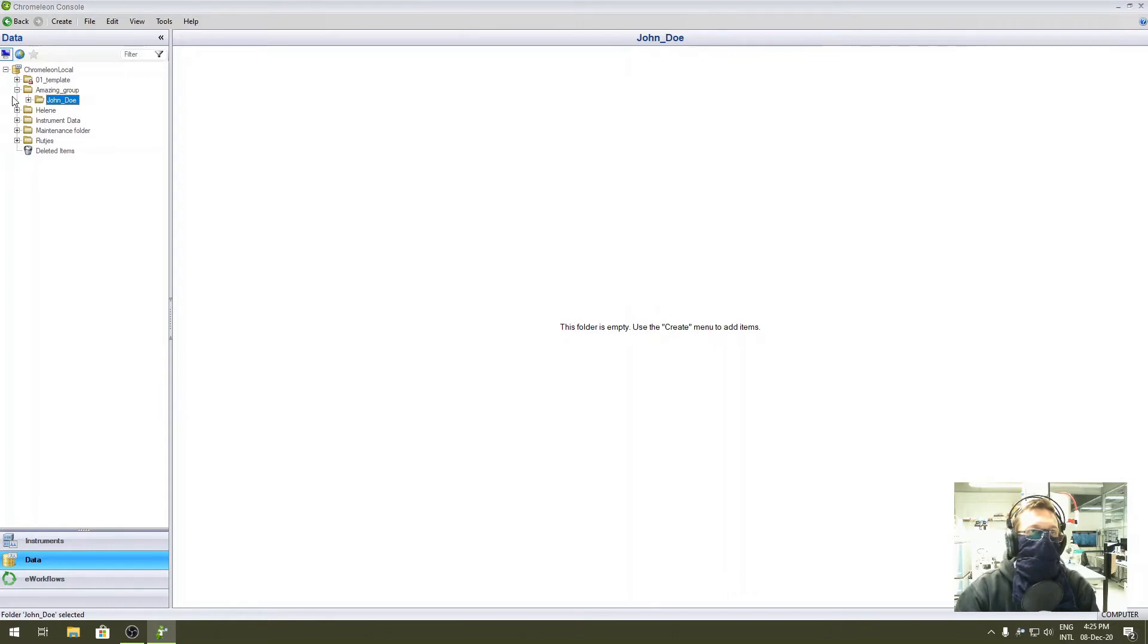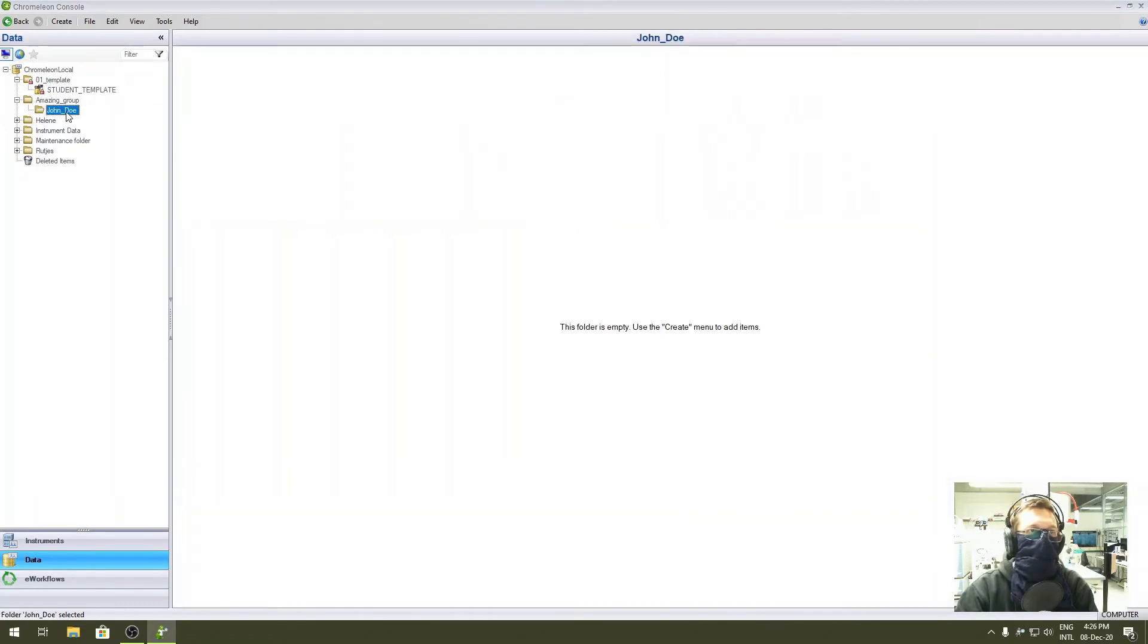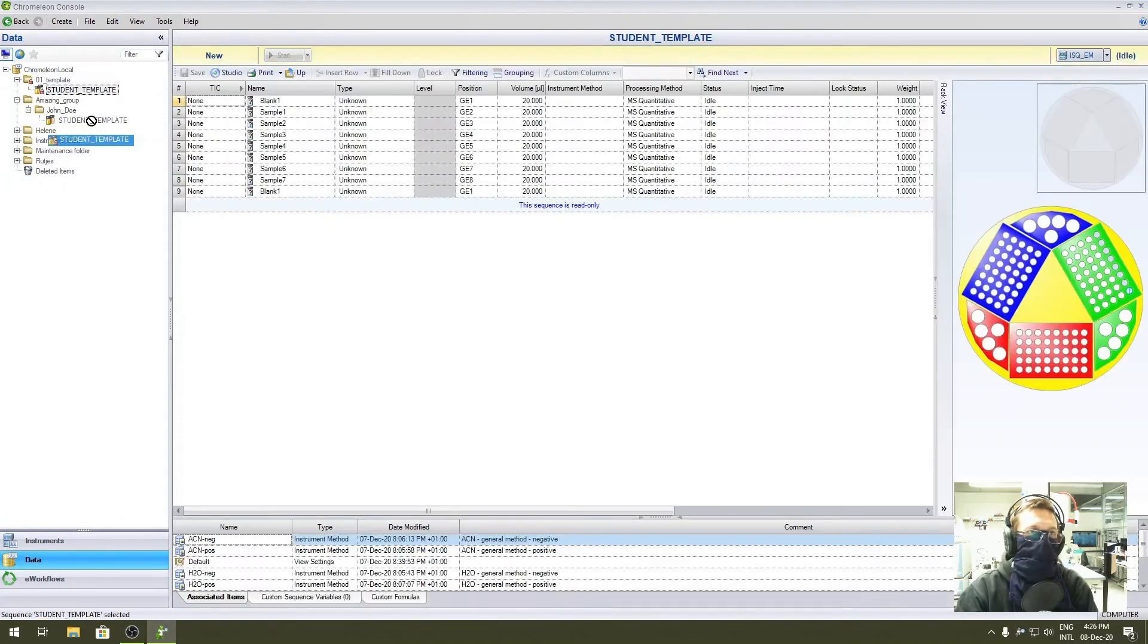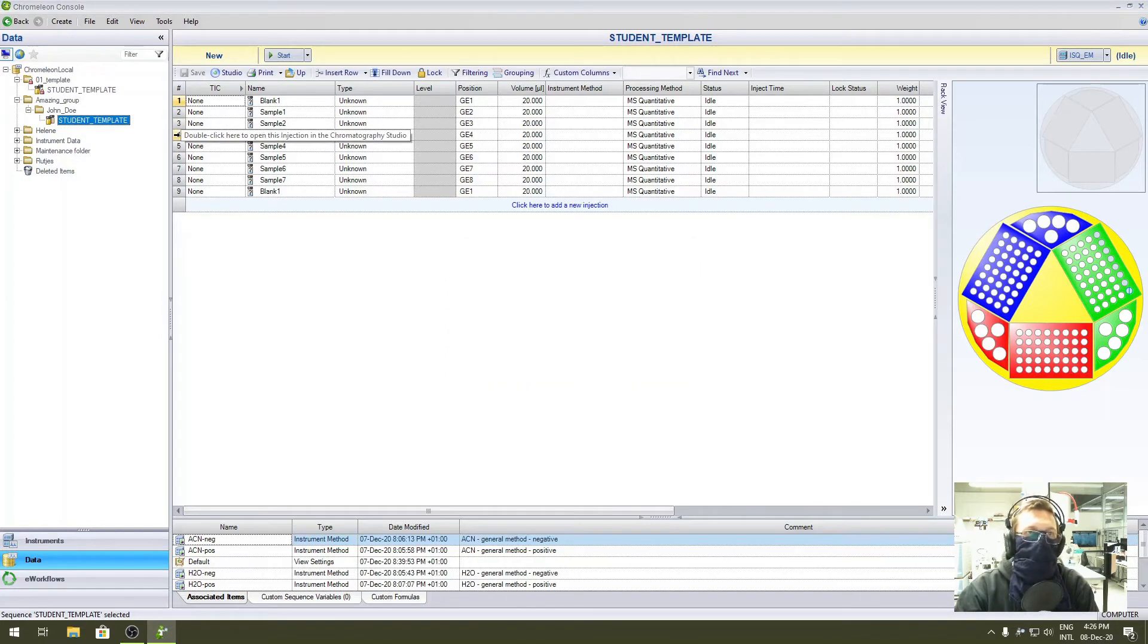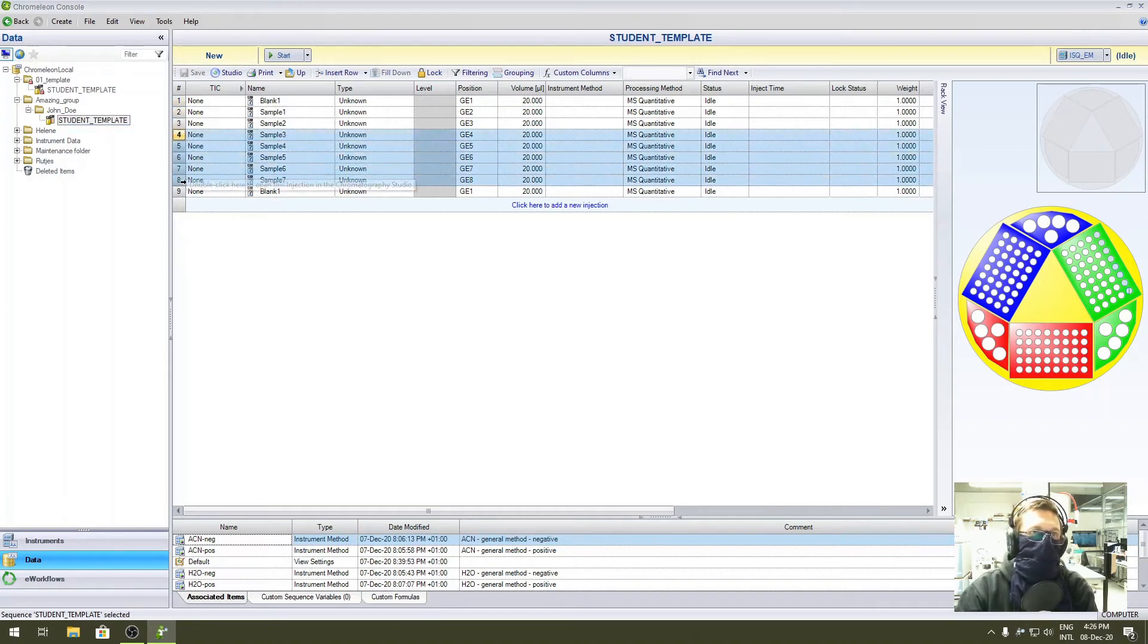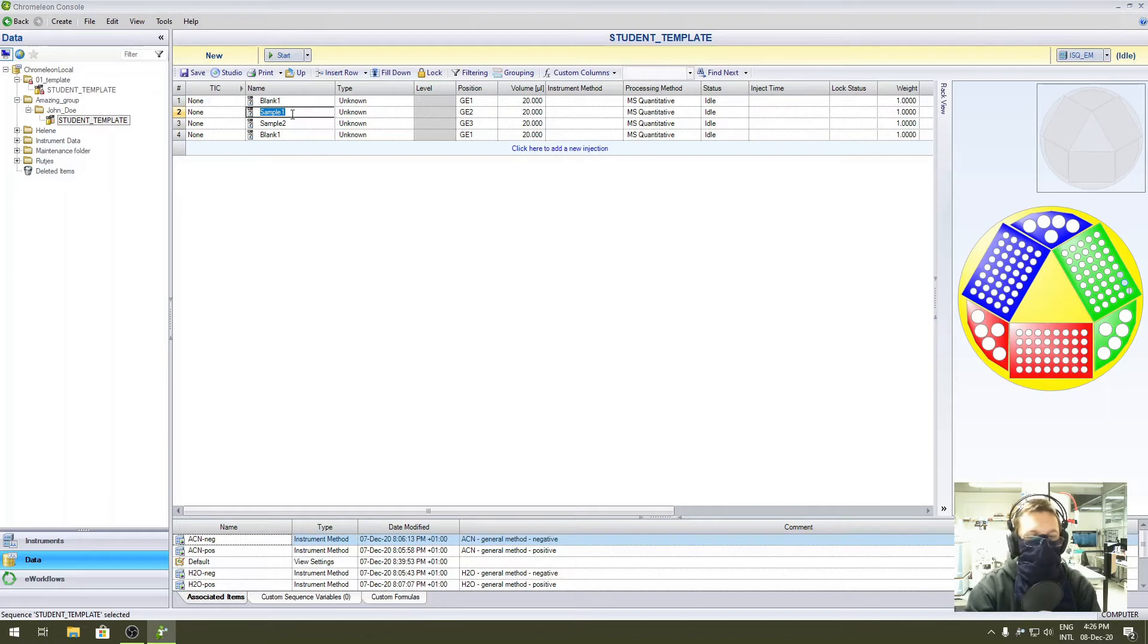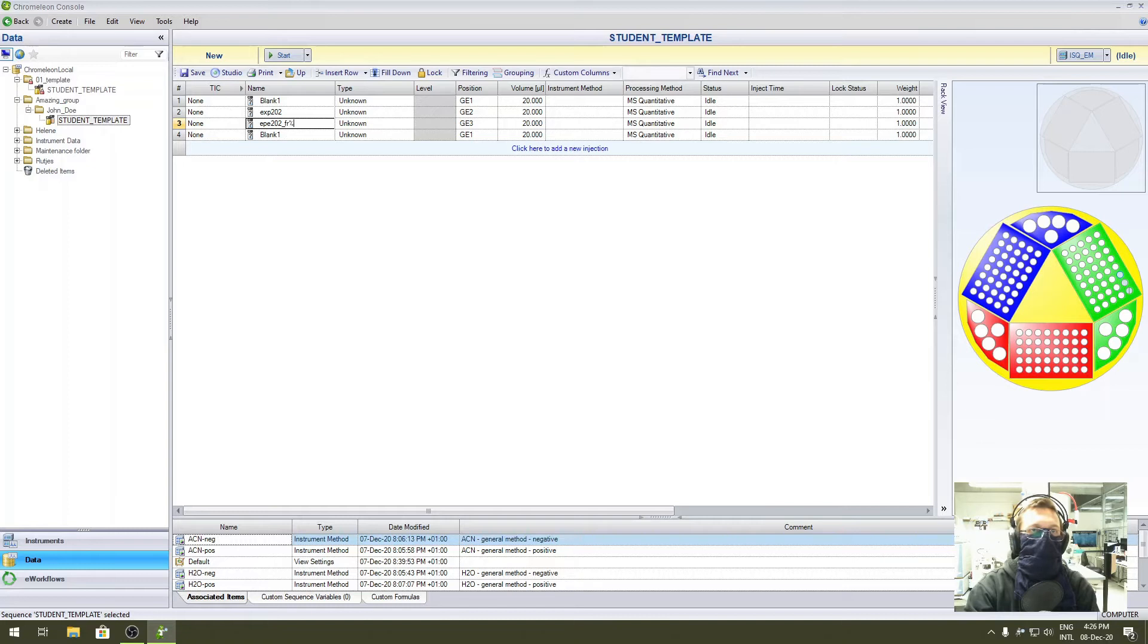Then you need a place to put your samples, so copy the template. Ctrl-C, Ctrl-V works, or you can grab it and move it. Here we submitted just two samples and a blank. So blank for the first try, sample 1, sample 2. Delete those samples, then blank at the end. Let's say this one is your experiment 202, and this one is experiment 202 fraction 5, for instance.